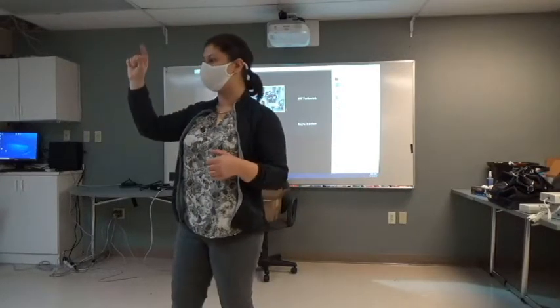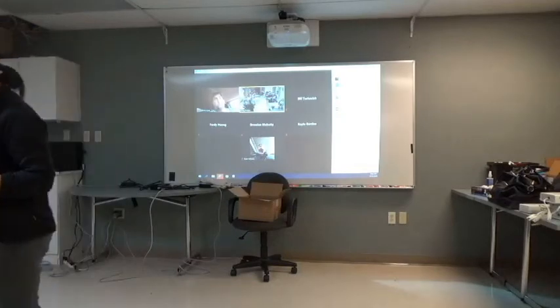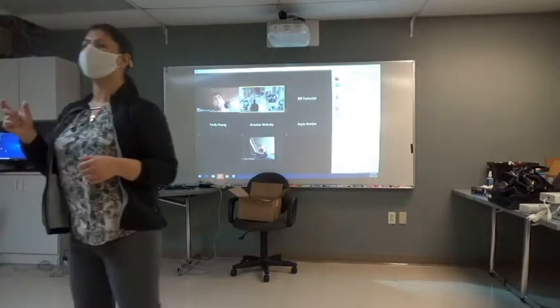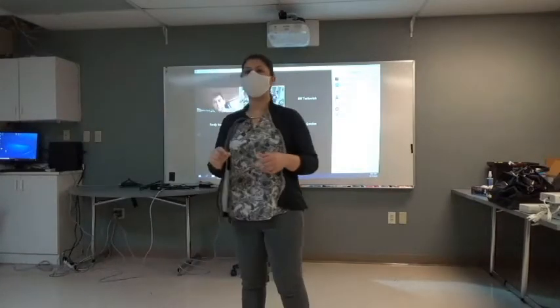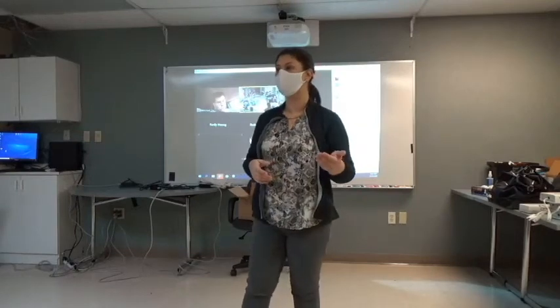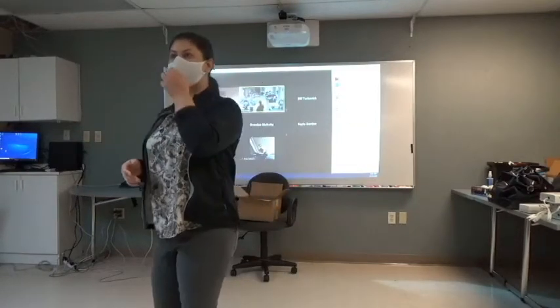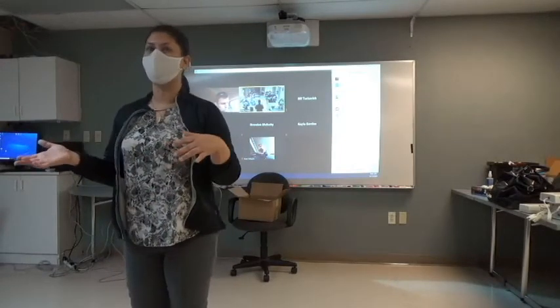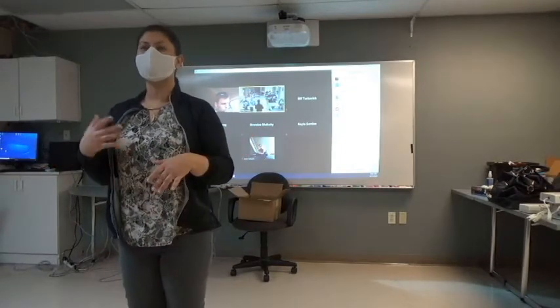So if you open up your pulse ox, you should have those black wings. Yep, those black wings are your carbon monoxide. And then that other thing I was telling you about, that perfusion index, that's a nice little tool. So if you're wondering, hey, are my patient's sats low because it's cold outside, or are they really low? This is going to help you out.